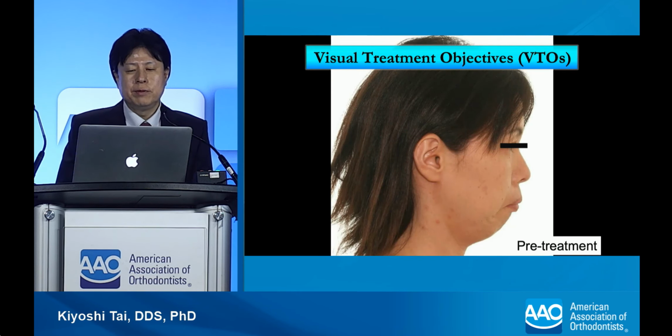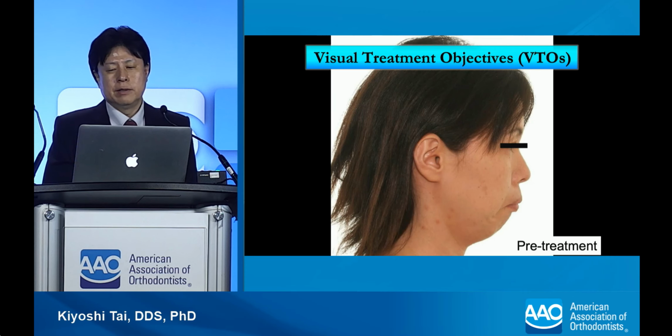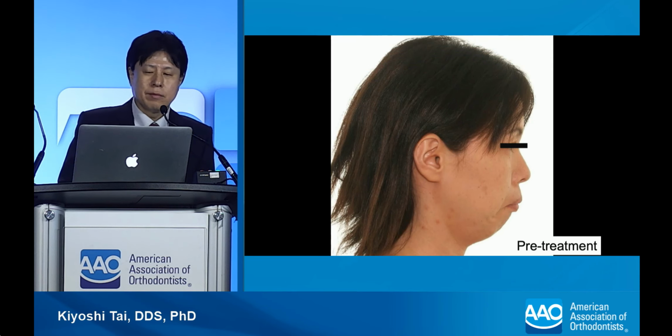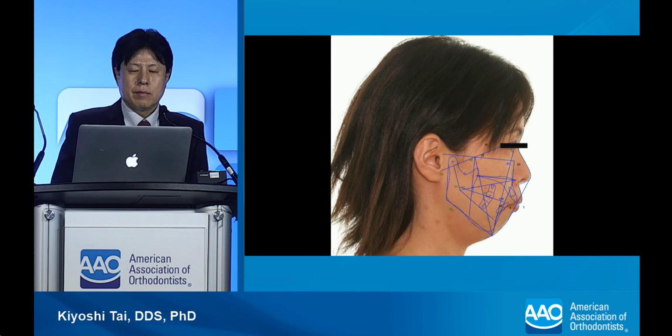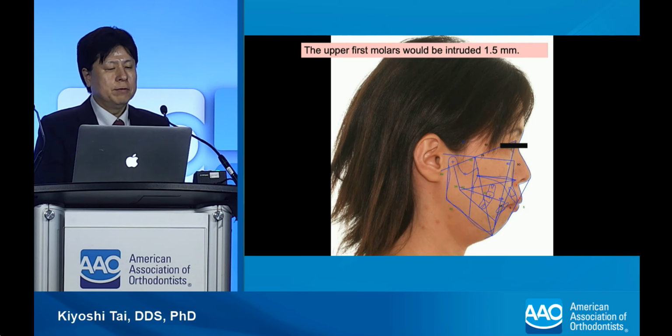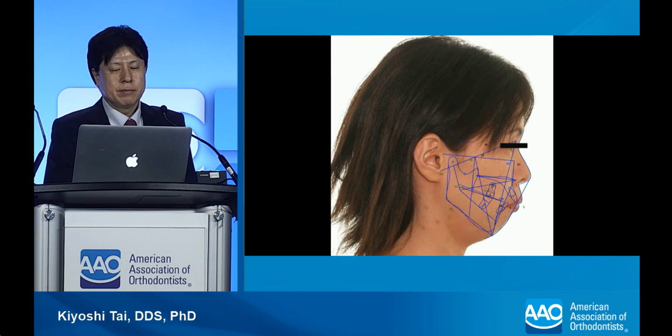Now I would like to demonstrate the VTOs of this patient. Here is a pre-treatment lateral photo. The upper first molar would be intruded 1.5 millimeters.